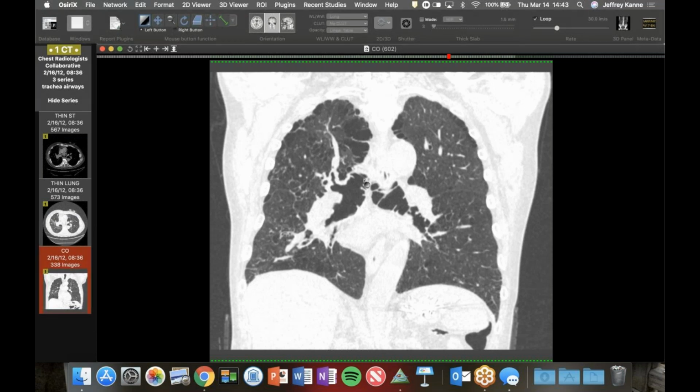Very dramatic, yeah. So I don't know what's going to happen with this patient. I don't know what you can do other than optimize their COPD treatment and secretion management, and then probably not a surgical candidate. So you could radiate the lung cancer. They're probably a stage 1 cancer at this point.